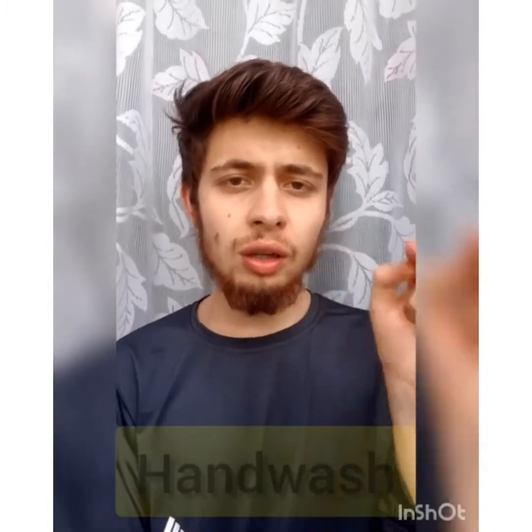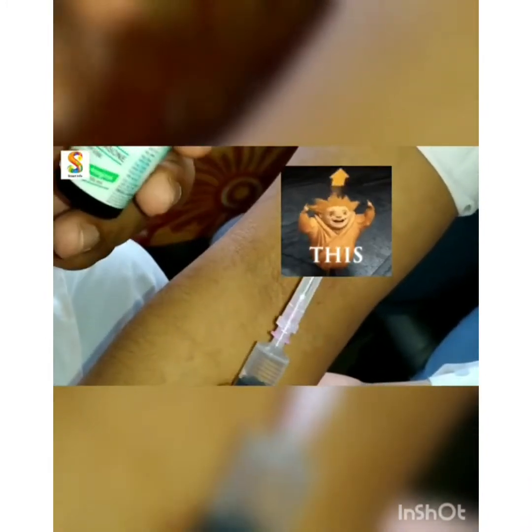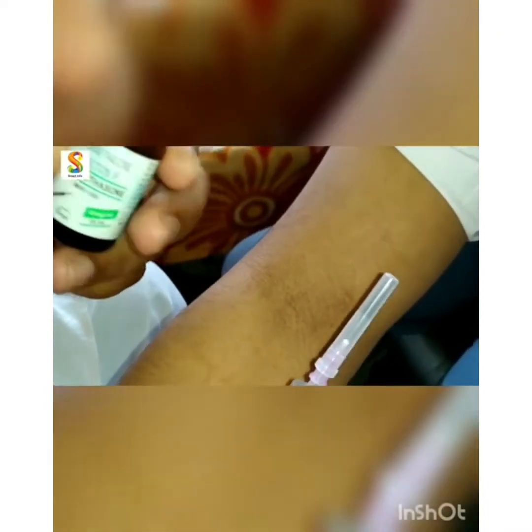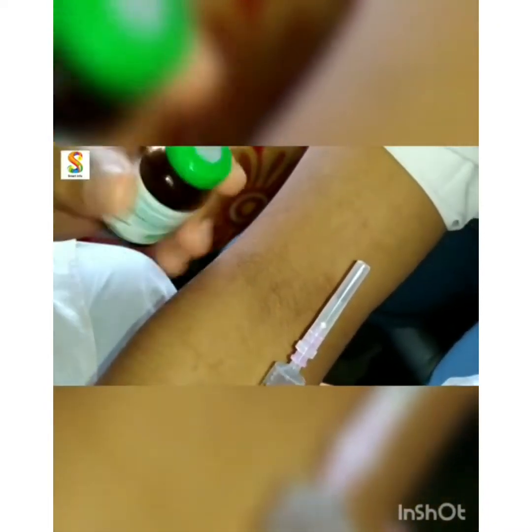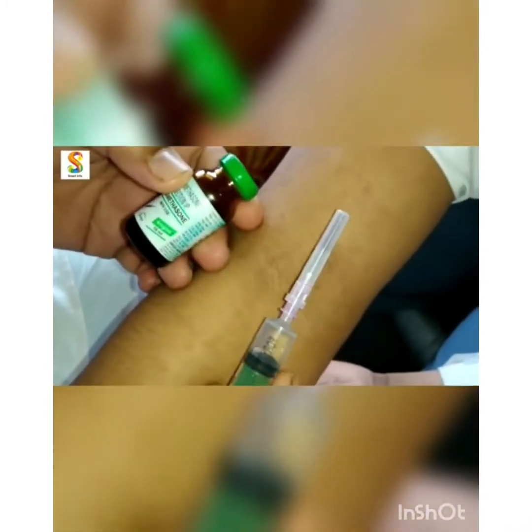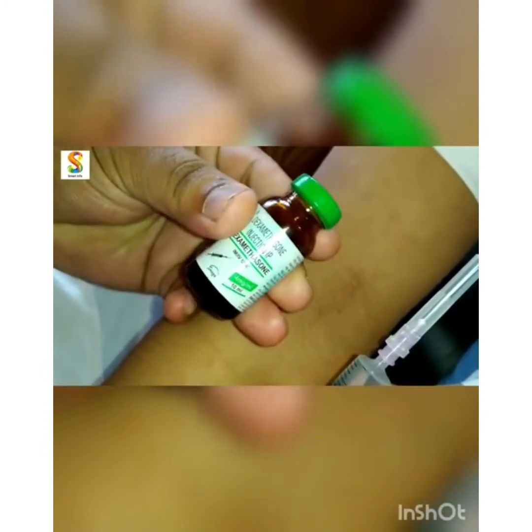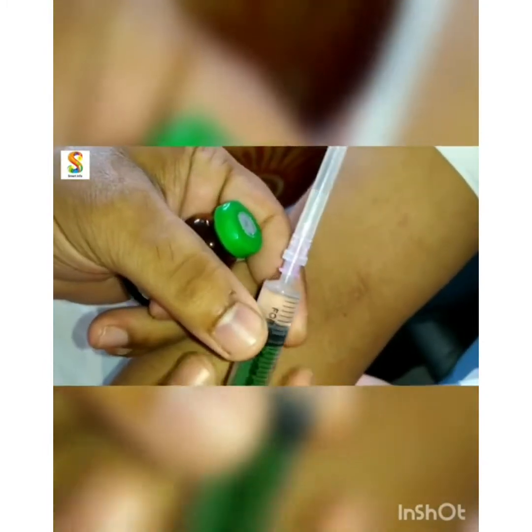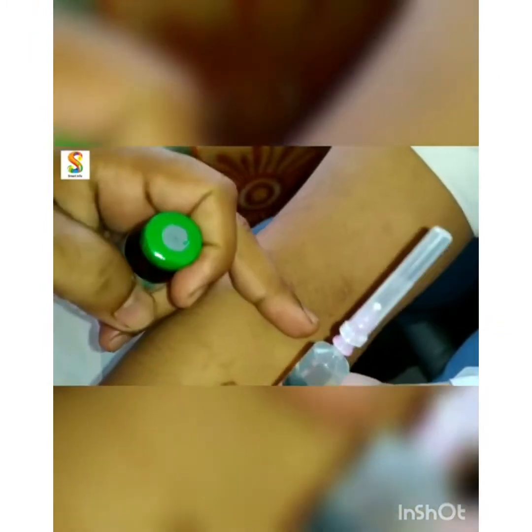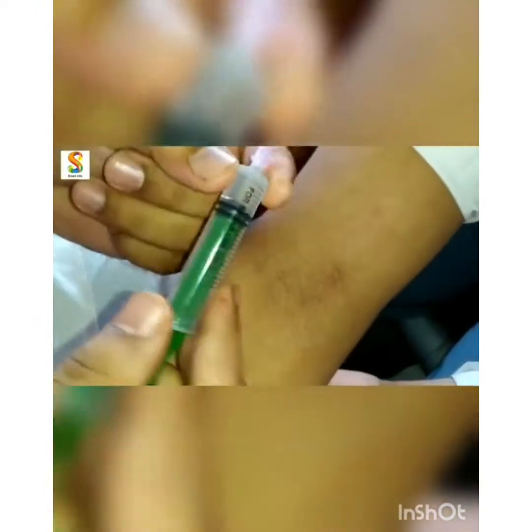So now let us have a look at the algorithm, how it is actually done. You can see there is a site which we have selected for the purpose of injection. We need a syringe, and here we are using a drug known as dexamethasone. As I will show you on the camera, I will zoom in, it's dexamethasone. We will use this drug to incorporate it into the vein of a person, which is the prominent vein there. I've already filled the injection into the syringe. Now you can see the person's veins; they are prominent here.